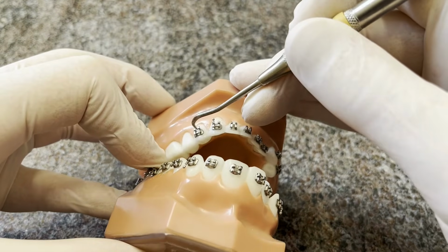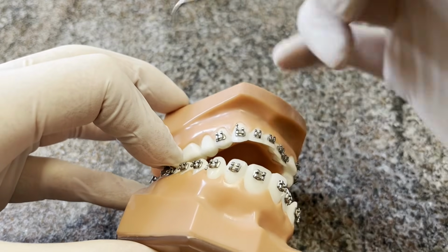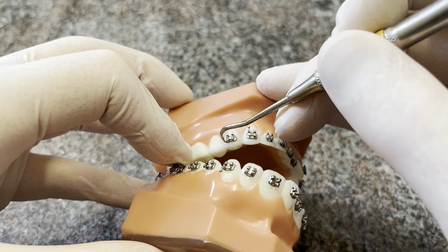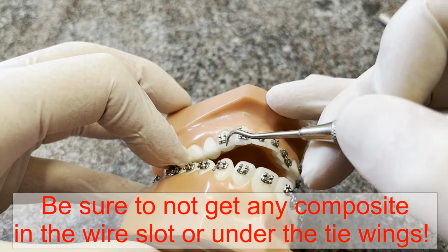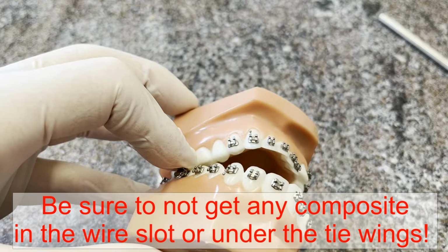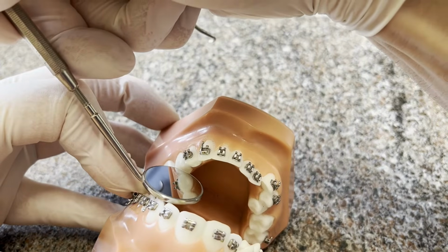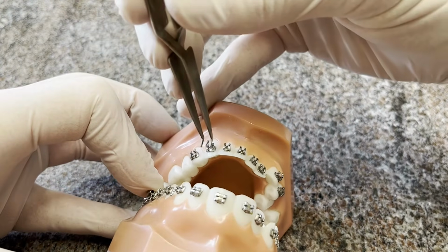Now once it's where you want it to be, you press down right here in the center, and that seats it into place and the extra glue squishes out. Then this is the most important step. You go around with the tip of your Explorer in contact with the tooth, and you scrape off the extra glue, wipe it on your glove or whatever. You just get all of that out. While you do that, you're going to move it. So then you reposition it back to where it should be. Then you recheck from the buccal to check your tip. Check from the occlusal to make sure your rotation is still good, and then you move on to the next one.